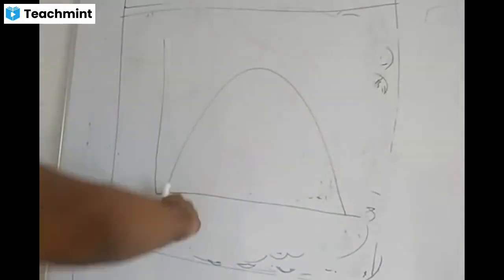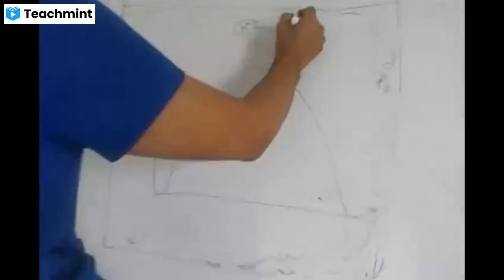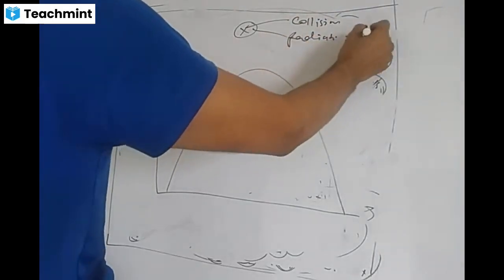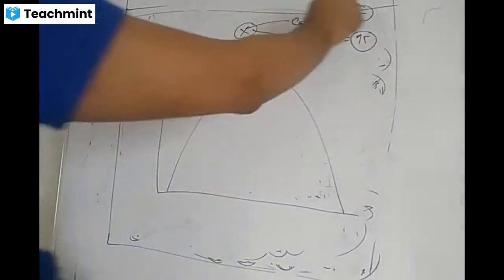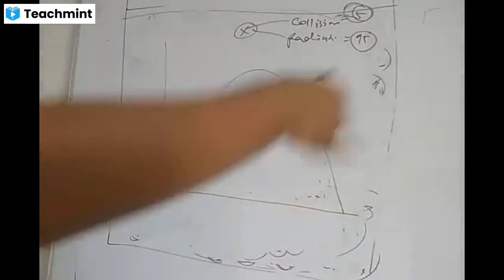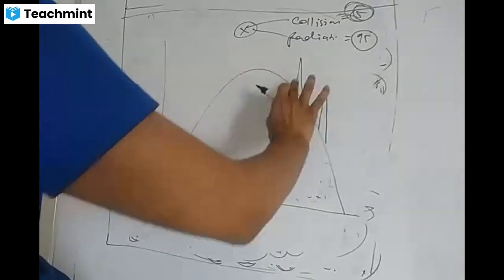So this broad spectrum will tell, in case of diagnostic X-ray, two mechanisms are there. One is collision, one is radiative. That will produce 95 and suppose it is producing 5. So where do these 5 lie in this graph? This is the 95 continuous broad spectrum, various energies are there. And where are the 5? These characteristic peaks.